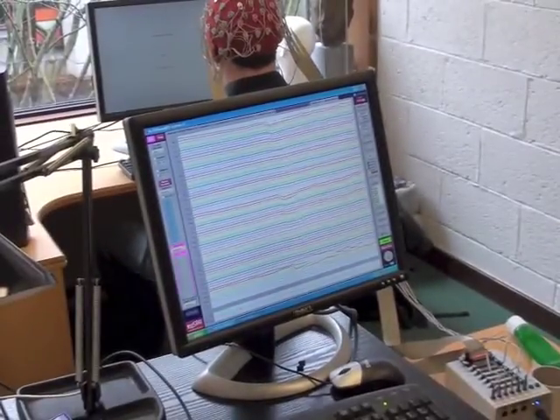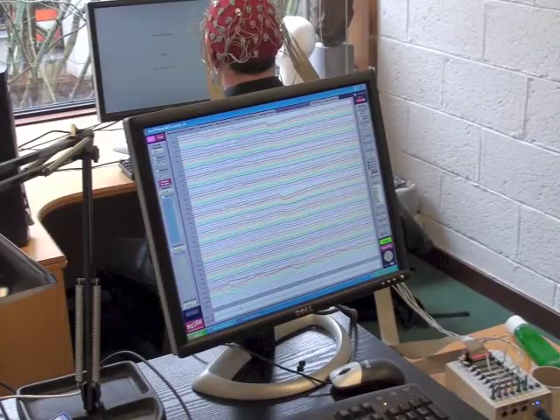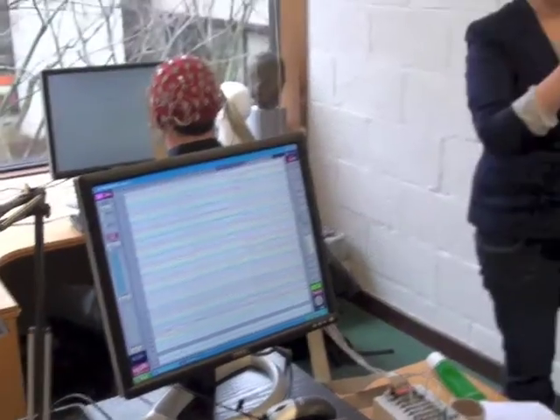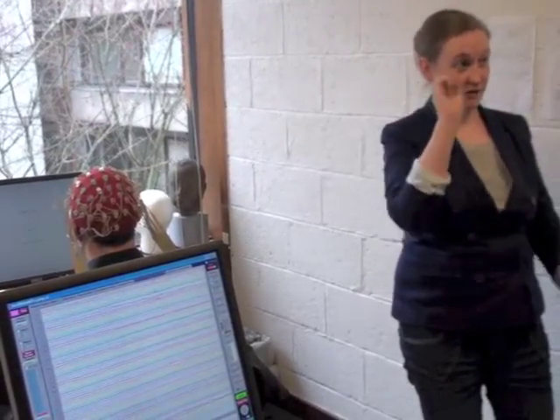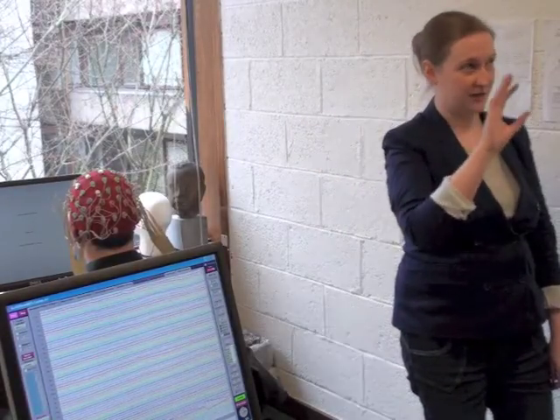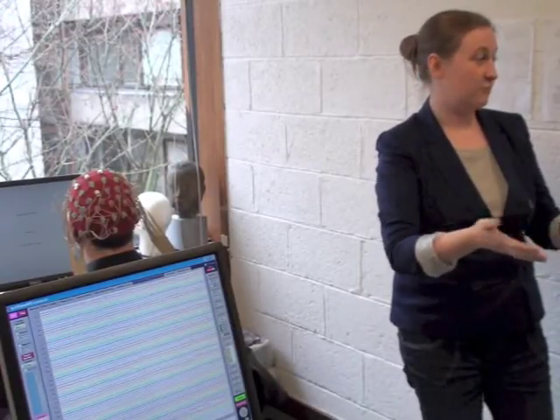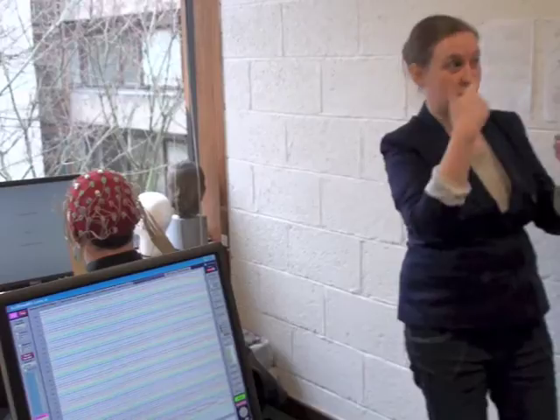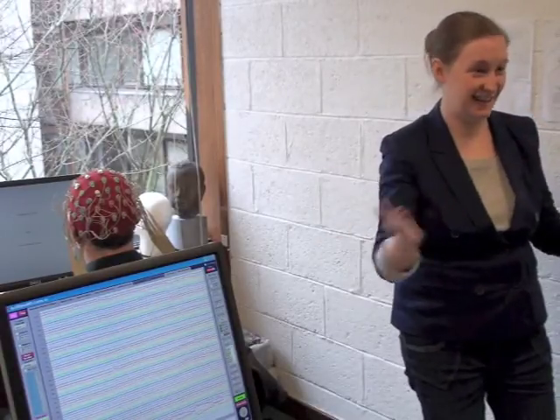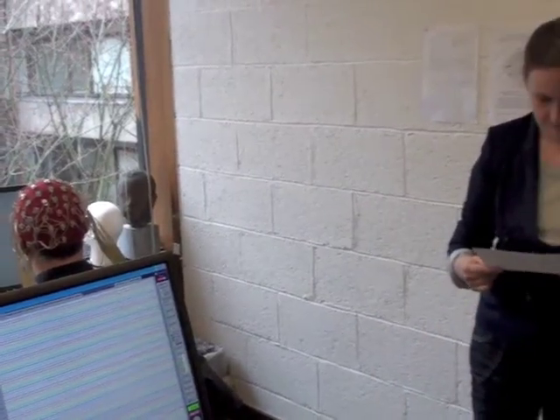The other reason you get alpha drift, and this comes down to designing the experiment, is with each stimulus that comes up, between each one is what's called an interstimulus interval. So basically just a blank screen between each image. If between each image I have exactly 1 second, it really induces alpha drift because you get used to picture, picture, picture. It's a terrible idea. If you have what's called a variable ISI, that could randomly vary between 650 milliseconds and 950 milliseconds, people's brains are much more engaged because it could come up at any time, really. Not like between 8 and 20 seconds, but a small variance. You don't get the alpha drift. And these are just tips from psychophysics.